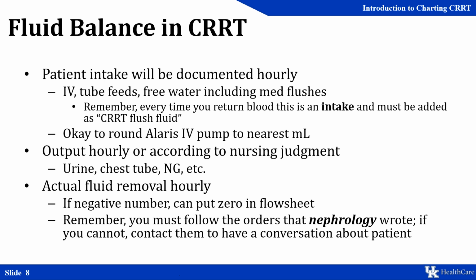However, if you're finding that your order is something like net negative 100 to 200, and your patient is maxed on 4 pressors with a high lactate, for example, you may want to call nephrology and have a conversation about the realism of that prescription. It may be more appropriate for that patient to pull even for a day or two. If your primary team and nephrology have differing viewpoints on how much fluid to pull, at the end of the day, it is ultimately the responsibility of nephrology to make that call. However, you can kindly direct the two teams to have a conversation with each other so you can enhance patient safety and collaboration.